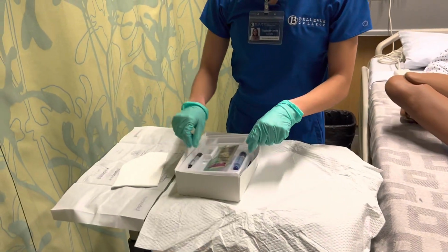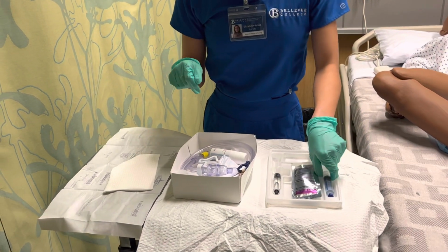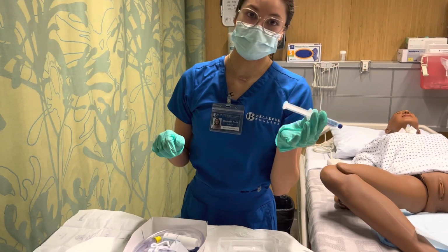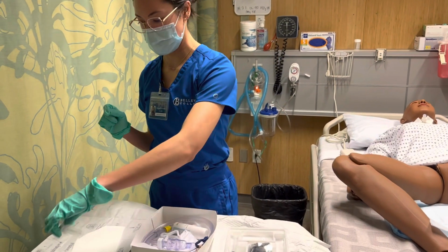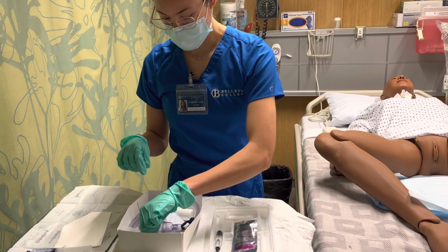Set these things up here. Alrighty, so this is the lubricant that we would be using on maybe a real patient, but we're going to use some Mani Lube instead. So I'm going to set that to the side. And let's set up this.